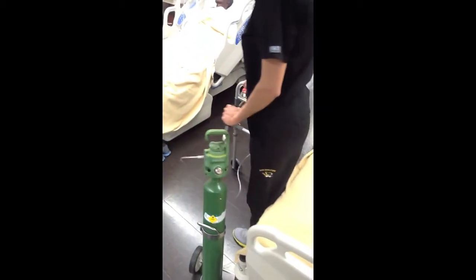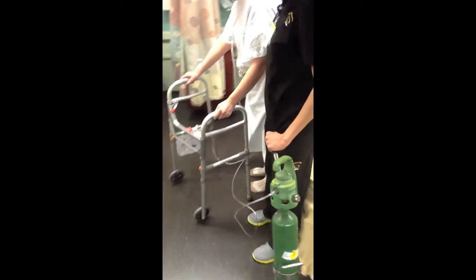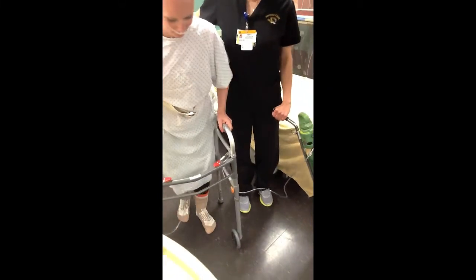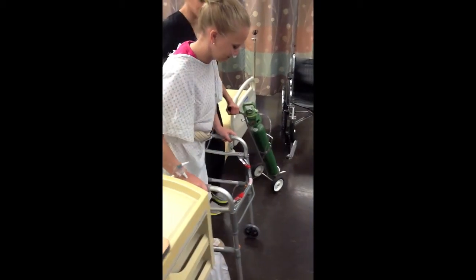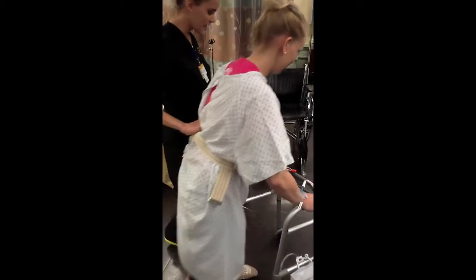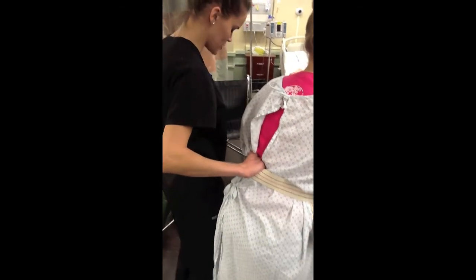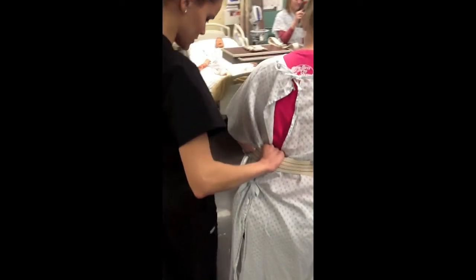Make sure the oxygen tank is in your non-dominant hand, so your dominant hand can remain on the gait belt of the patient at all times. Communicate directions to the patient so they know the plan. Also have a backup plan and have a second nurse follow you with a wheelchair in case the patient becomes tired. Also assess the patient's ability to ambulate frequently and ask them if they are feeling fatigued and need to sit down.